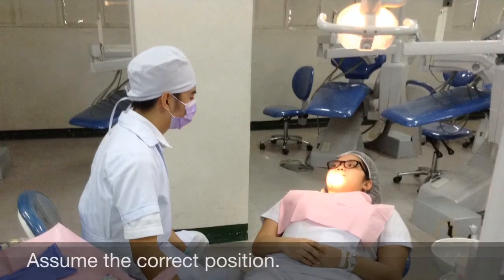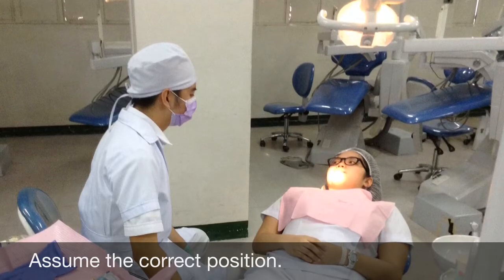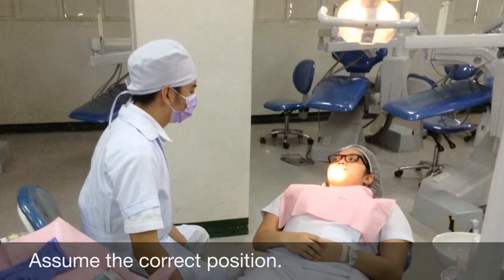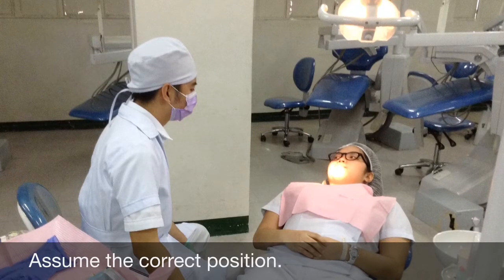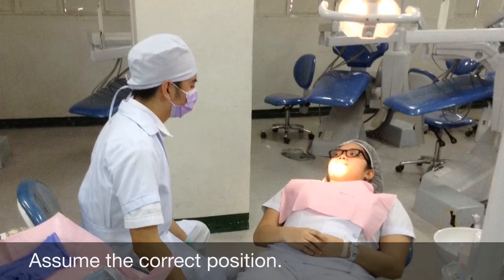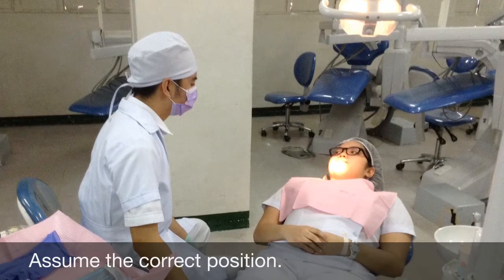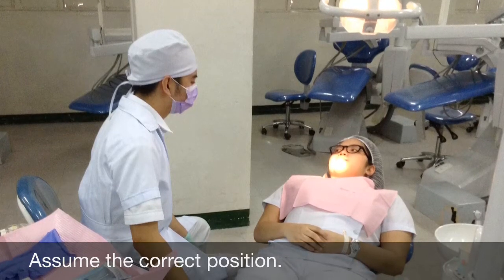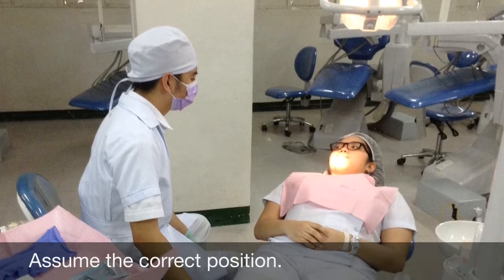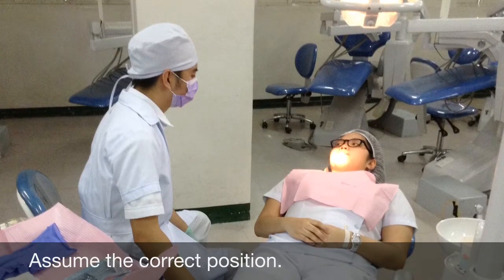First, assume the correct position of the patient. For the right inferior alveolar nerve block, a right-handed administrator should sit at the eight o'clock position facing the patient. For the left inferior alveolar nerve block, a right-handed administrator should sit at the ten o'clock position facing in the same direction as the patient.